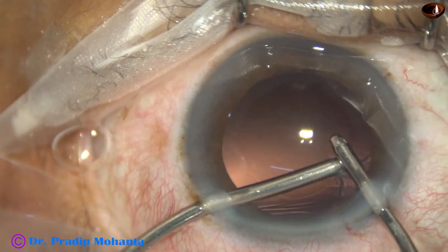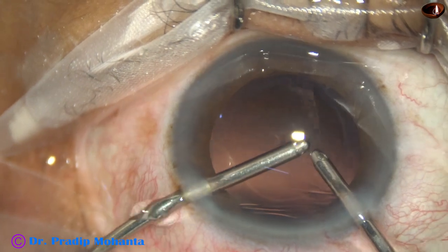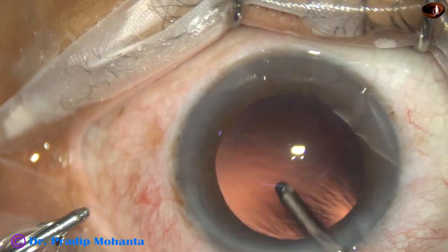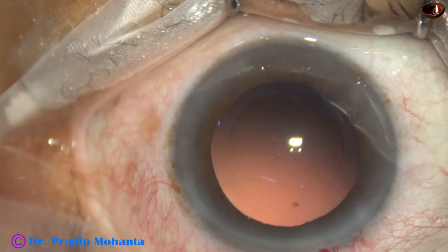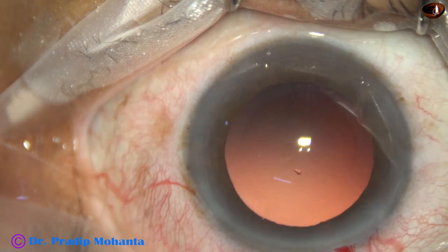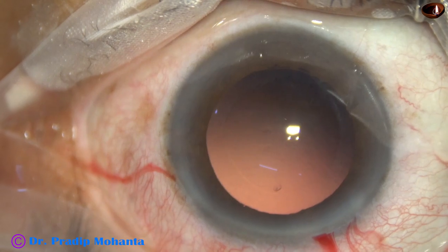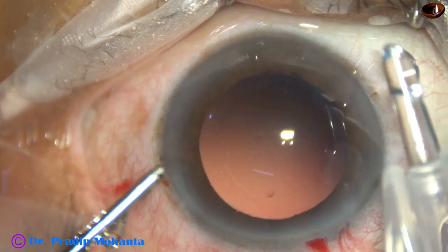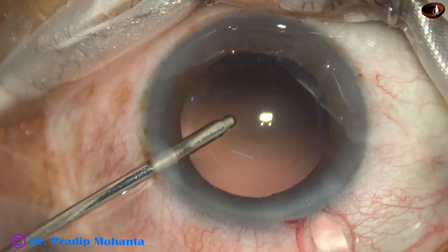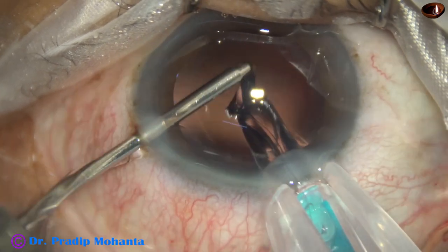I am using irrigation aspiration for sub-incisional cortex. When we lift up the anterior wall of the main wound, the anterior chamber is nicely maintained and we can remove the sub-incisional cortex. We do not need another side port to use the bimanual. Most of the cortex has been removed by Simcoe cannula; only the sub-incisional cortex has been removed by bimanual.